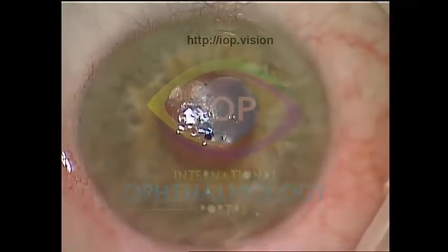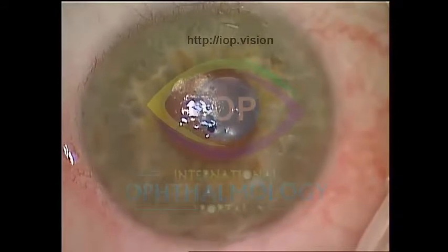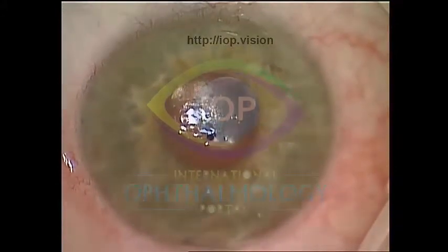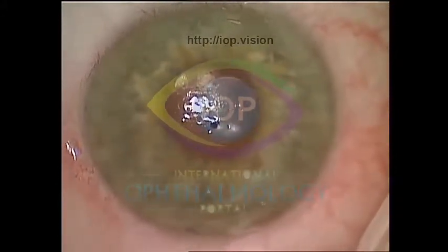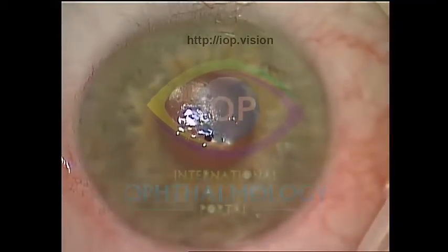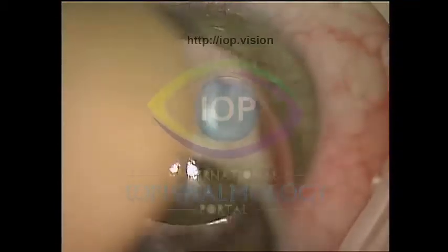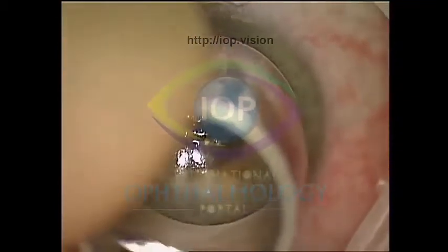I've always done a corneal incision, and certainly if I'm doing a combined procedure like a clear corneal phaco, I'll go through the same wound to put the graft in. But with the clear corneal incision, I do make it a bit shorter than I would for a phaco.